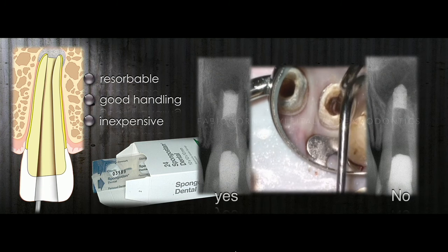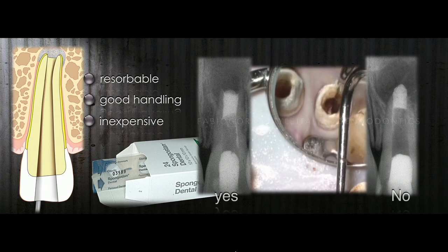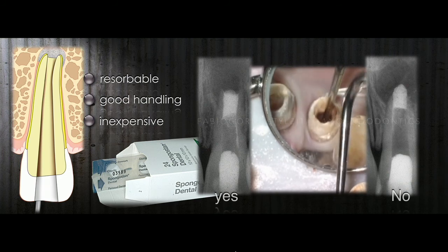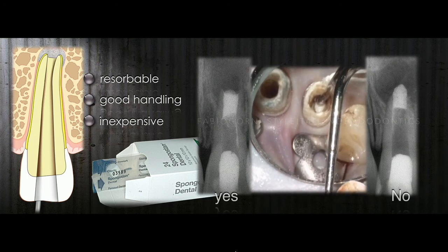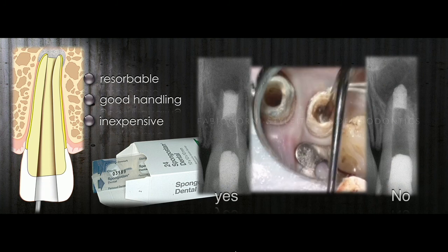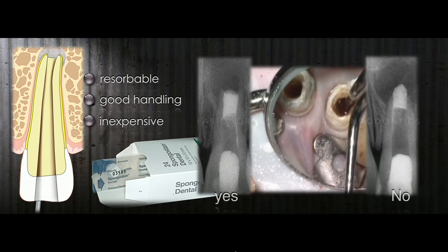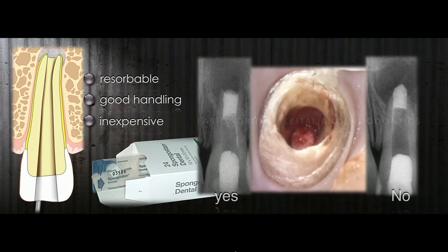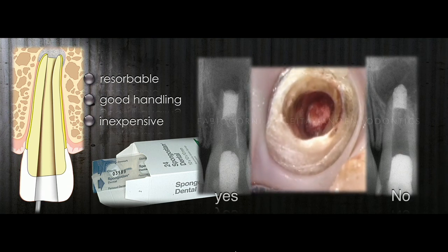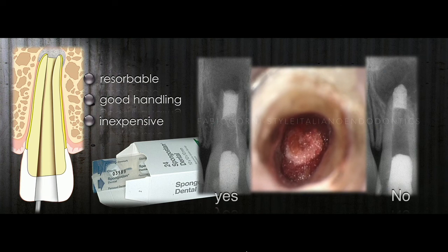If we are not using microscopy, we can check the depth of the material through the working length. The action is a simple action, and the larger the foramen is, the easier it is to push the material outside of the root. Now the barrier is positioned, so now we can try to use the material.